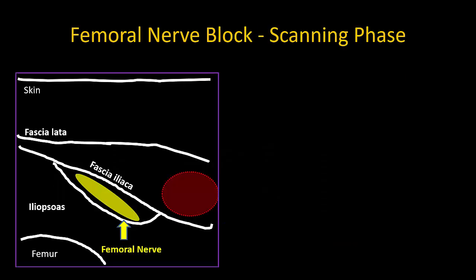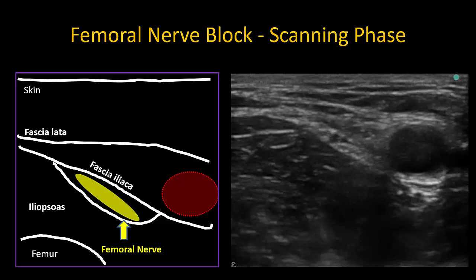However, in most patients, the femoral nerve is usually located well lateral to the artery and on top of iliopsoas, under fascia iliaca, and usually has an elongated elliptical cross-section.